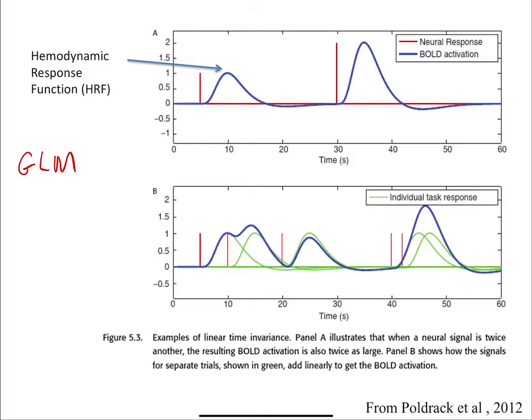The idea here is in red we're showing, for example, that if you have a hemodynamic response with a stimulus, let's say we just hammer it with a very short, brief flash of light with an amplitude of 1, you're going to get this response. The hemodynamic response, for those of you who are more techie, is what's called the impulse response. It is the response of the brain to a very brief stimulus. How have we measured this? Mostly through visual experiments where they give a brief flash of checkerboard and look at the response.